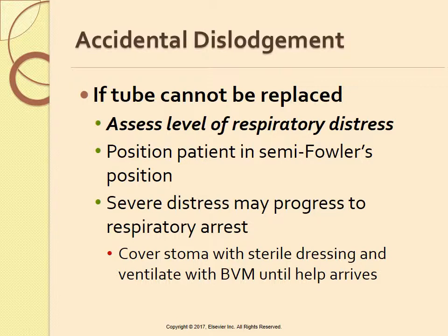If a patient has had a total laryngectomy, there will be a complete separation between the upper airway and the trachea. Ventilate this patient through the tracheostomy stoma.